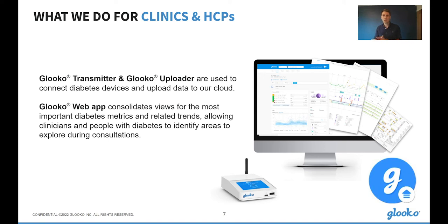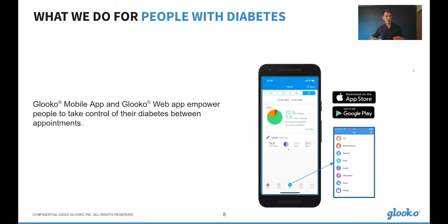We can also see reports that are specific to different devices, perhaps looking at events that are unique to insulin pumps. And we also have more traditional views, such as the logbook, which I know is a popular view for many healthcare professionals.